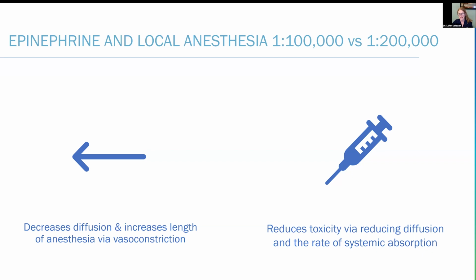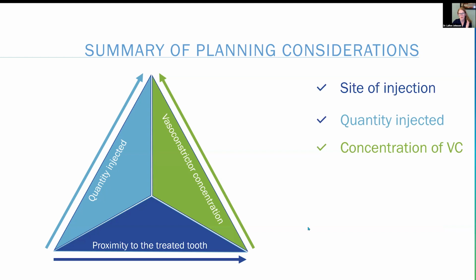And it might actually hinder what I'm trying to do by decreasing diffusion, because I want it to diffuse through the bony space. So I have to rethink what we're doing. And again, I love these slides. These are from Dental High Tech.